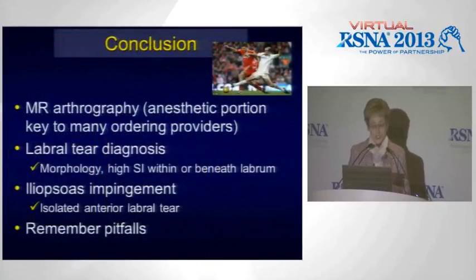So, in conclusion, what we've discussed is MR arthrography remains the workhorse at this time to assess the hip labrum, and it's the anesthetic portion at the time of injection that is the key to many ordering providers.